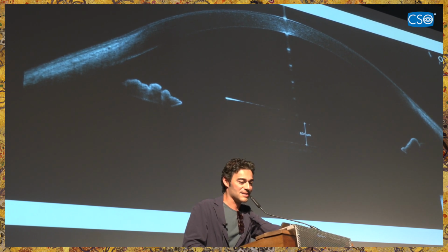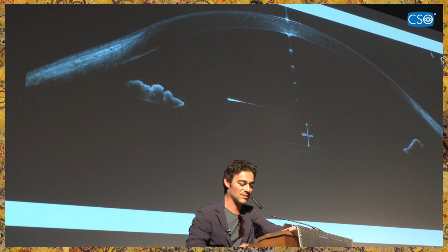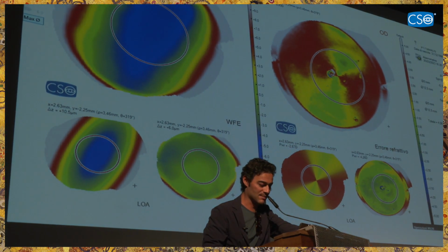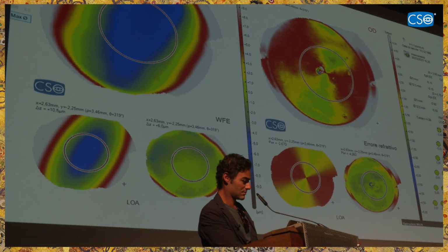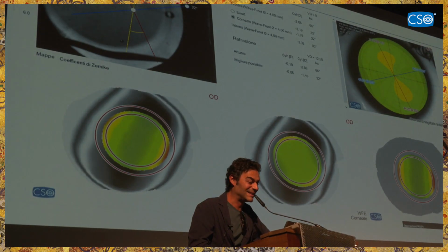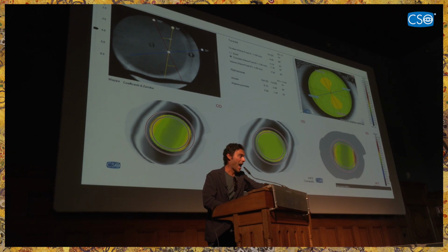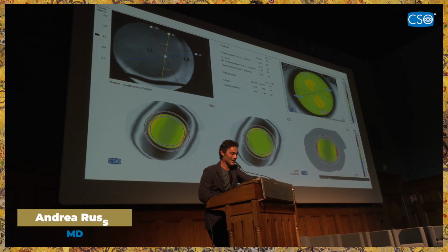This is another very interesting case. We heard about the decomposition of the wavefront for our patients, for instance, for therapeutic reasons. Apparently this was a perfect case because the vaulting was 600 microns. However, there was some residual astigmatism in this patient, as you can see here. So we did the difference between the whole wavefront and the corneal wavefront. And as you can see, the lens was decentered by 30 degrees. And we all know that there is a decrease in the toric capabilities of correction. We could fix it thanks to the software.